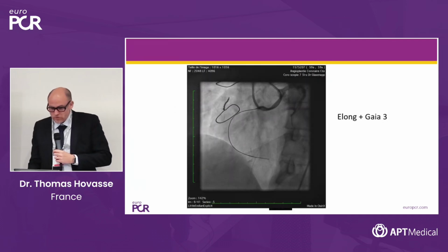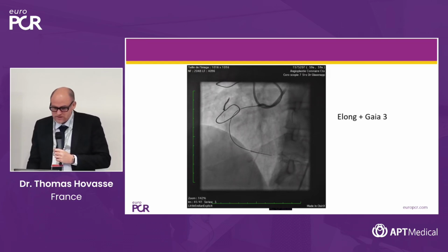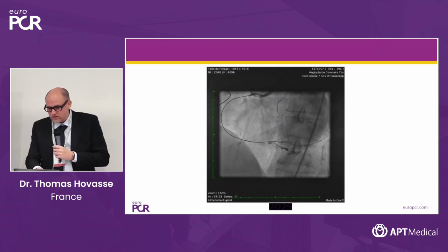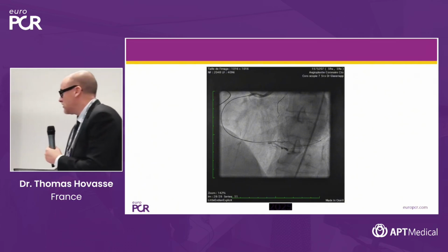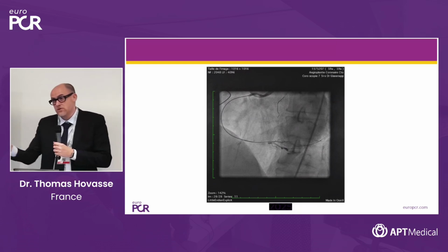So we are progressing, still in the architecture of the vessel, so we are quite happy progressing with both the wire and the micro. But now you can see that we are not in the distal lumen of the RCA. Maybe we went a little bit up at the end of the CTO here, and we missed the distal cap. So at this point, for sure, you will have to stay with the micro before the bifurcation if you don't want to lose the bifurcation.